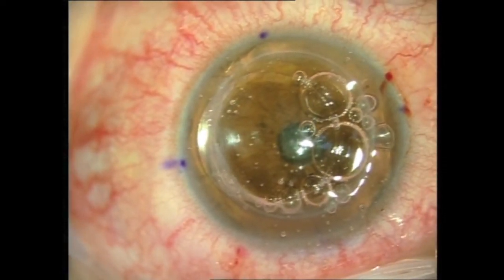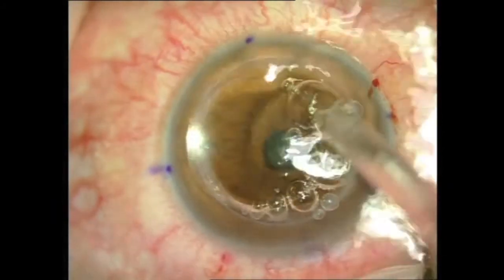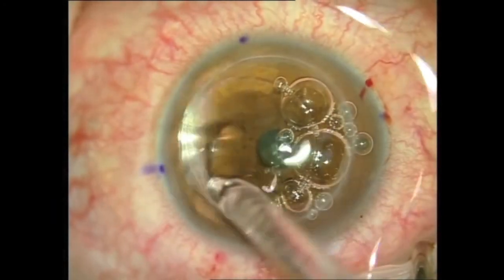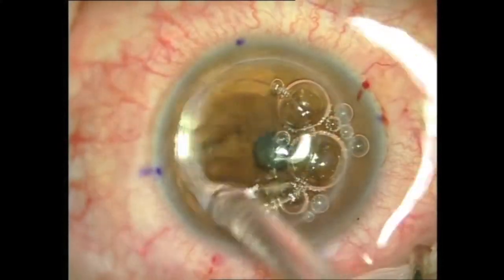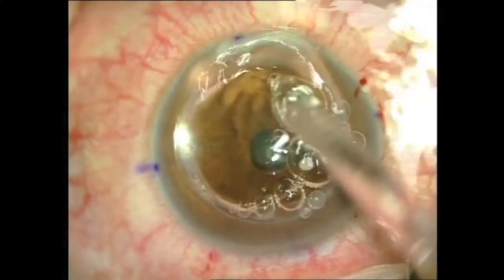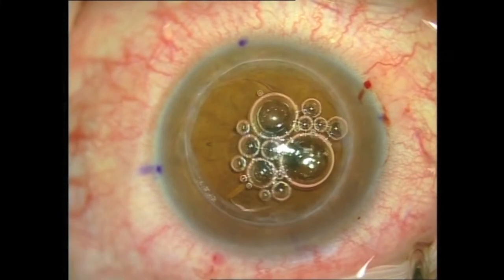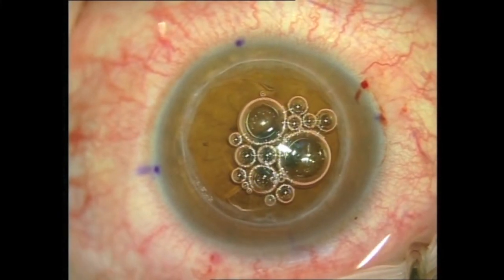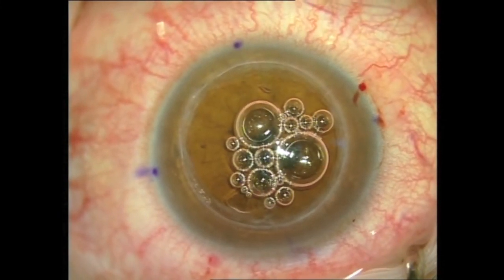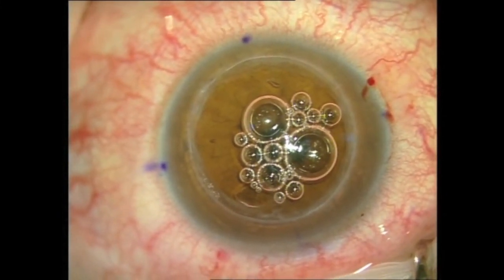Now the type 2 bubble is evident. I am going to wash the viscoelastic over the pre-Descemet layer, and interestingly there is a spontaneous collapse of the type 2 bubble.